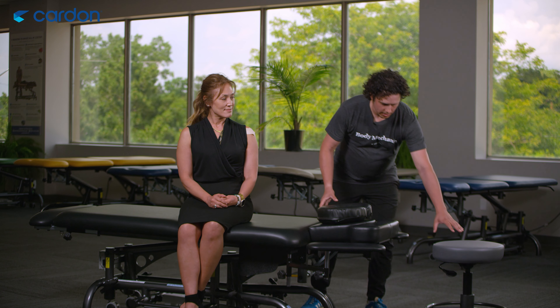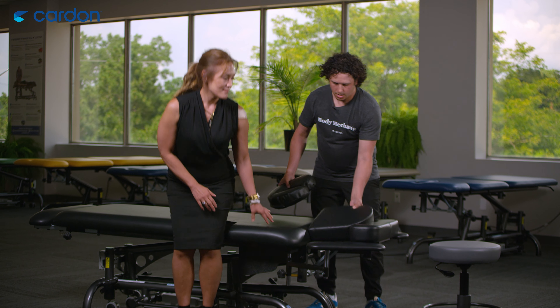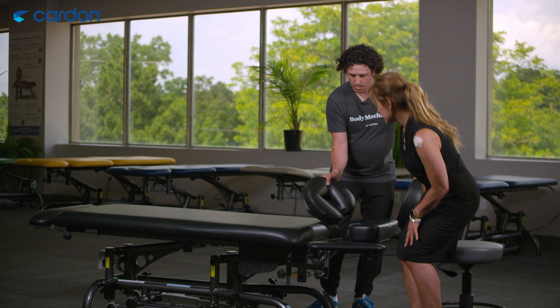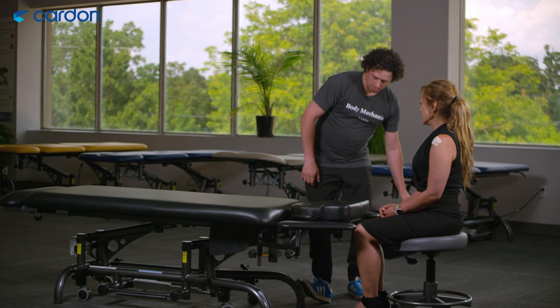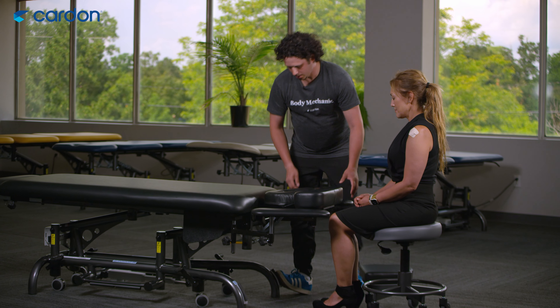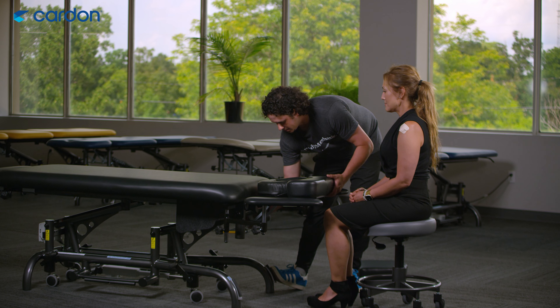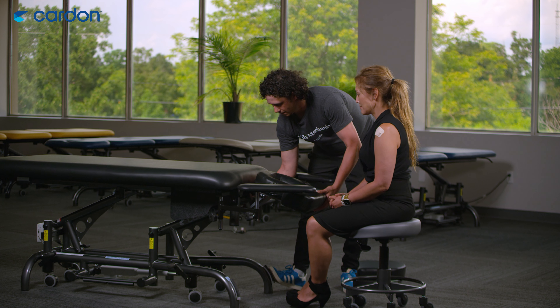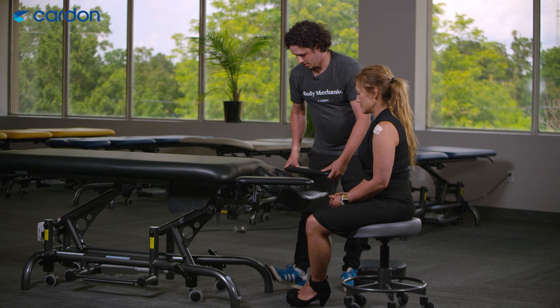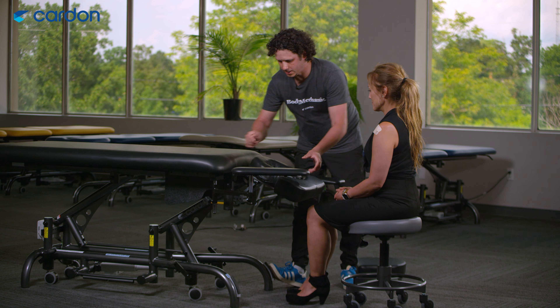I'm going to get Chris to come over here and sit on the stool for me. I'm going to take this out, flip the headrest the opposite way, and then raise the table all the way up. At the same time I'm going to drop the headrest down and then drop my armrest down as well.